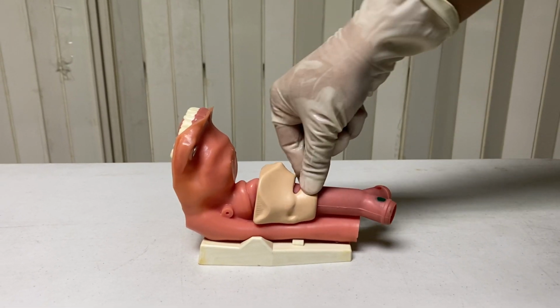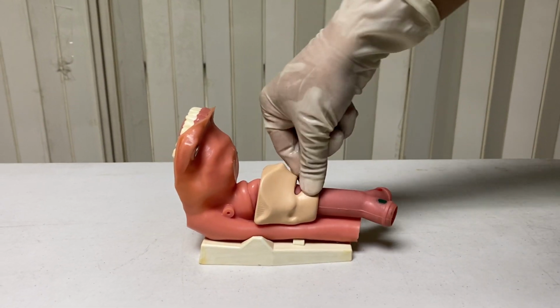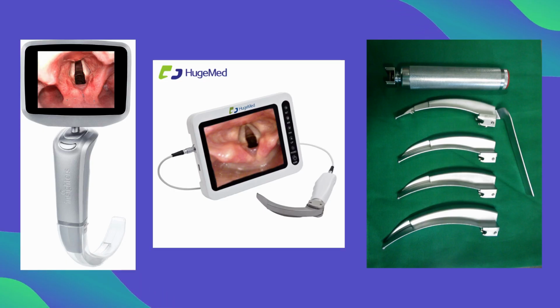Once the patient has been fasciculated and relaxed, increase cricoid pressure to 30 newtons or approximately 3 kilograms and proceed to intubation. Due to obesity, video laryngoscopy is the method of choice. If not available or due to physician preference, direct laryngoscopy may be used.